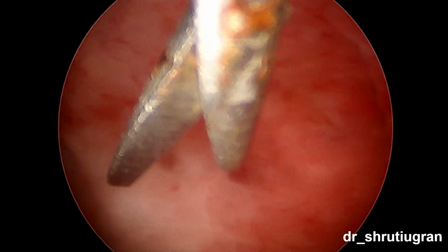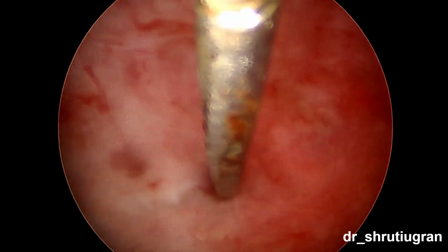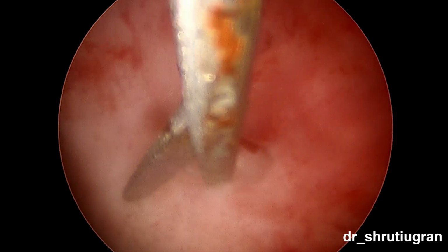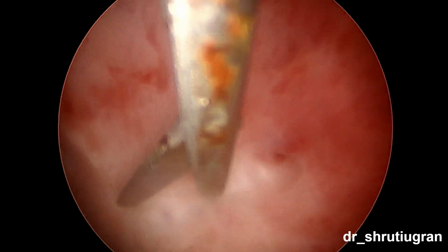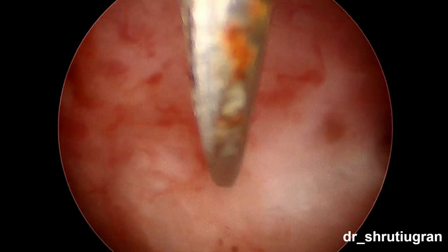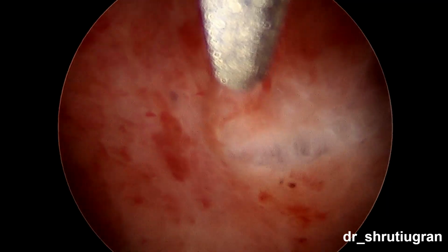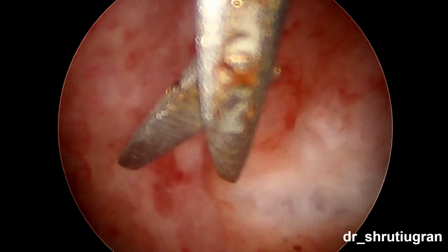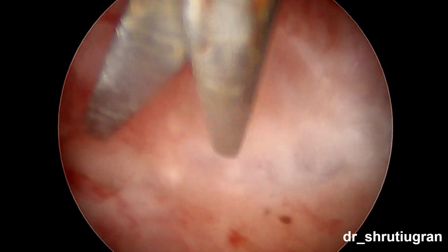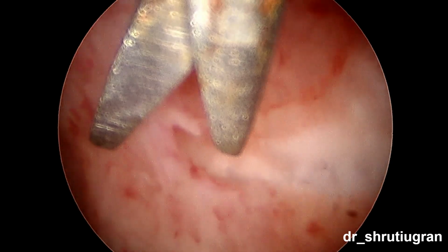What we did next was an endometrial scratching. As we all know, endometrial scratching is the standard process that we do. And here, when we hit the myometrial cyst, we can see the tarry chocolatey fluid coming out, suggestive of endometrial tissue there. We went ahead with the endometrial scratching, which is known to increase the chances of implantation at the fundus.